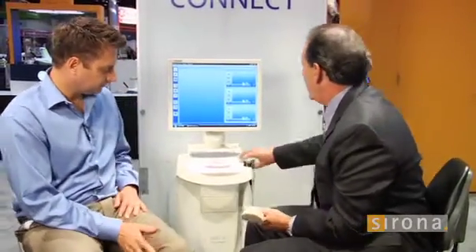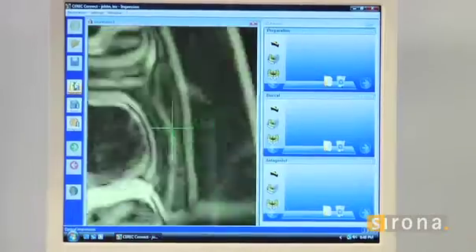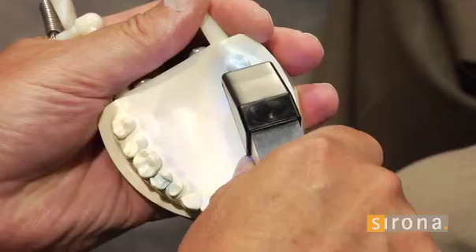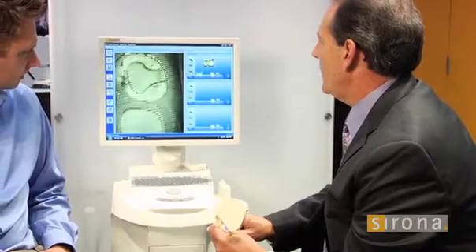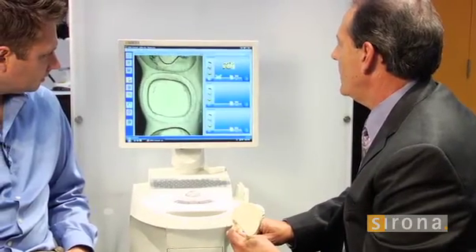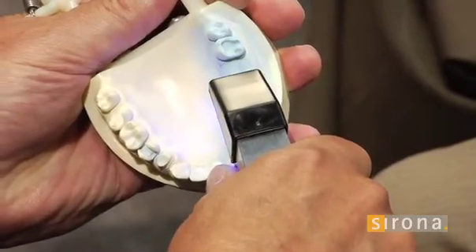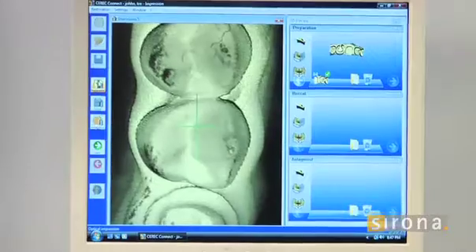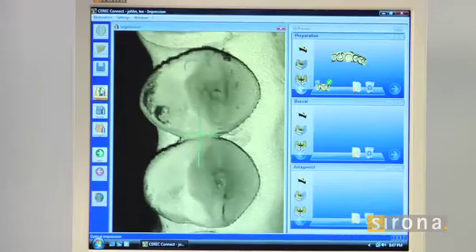We'll do a half arch here for time's sake with the Bluecam. There are different settings on here for tolerances in taking the scans, and it's constantly taking pictures. But when you hold still, that's when the pictures line up and it stitches things together. I'm always looking at the screen, not in the mouth — I just have a feel after having done this for 10 years. When I get to the bicuspid area and get that stitch, I roll to the buccal because you'll see later how that buccal scan comes into play.